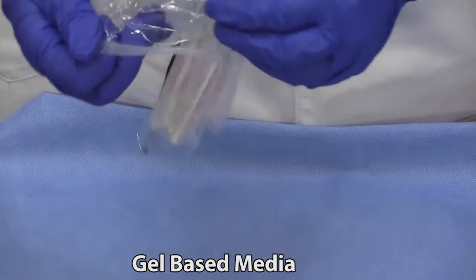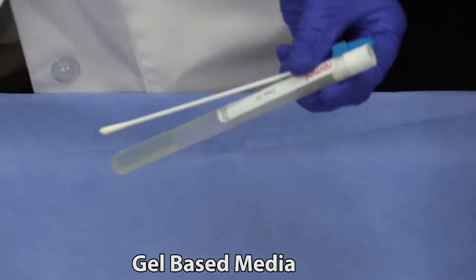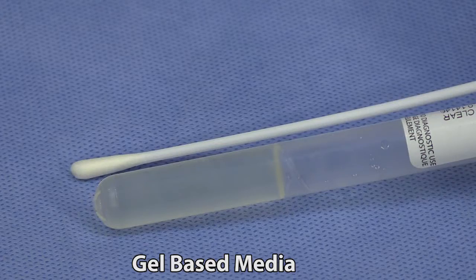Swabs in gel-based media can be used for both aerobic and anaerobic culture. However, they cannot be used for PCR testing.